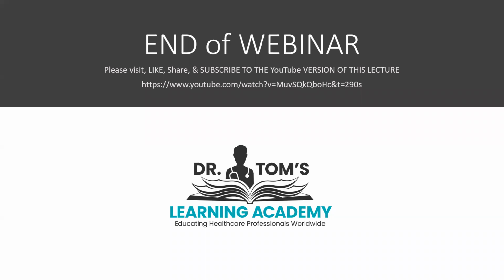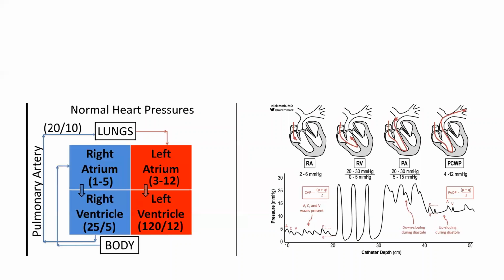Okay, so that ends my presentation. The pulmonary artery and all those pressures are going to be displayed, and we're not going to have time to discuss that in detail, but this should give you a prelude to what you will see in echo. It will describe more about the pulmonary artery pressures as well as the pulmonary wedge pressures. So we focus more on right atrial pressures.